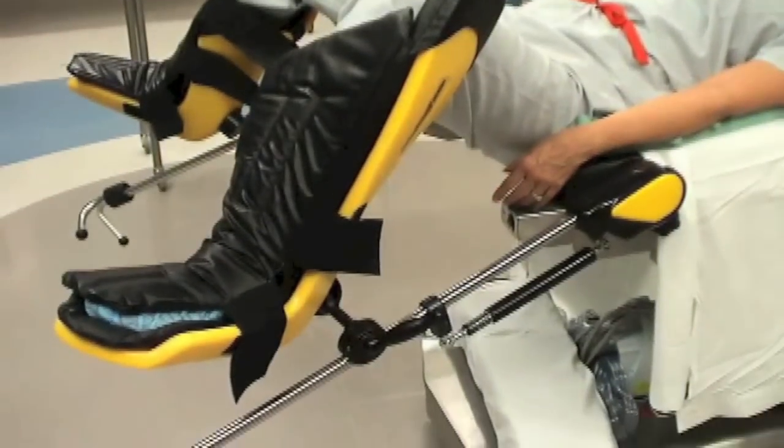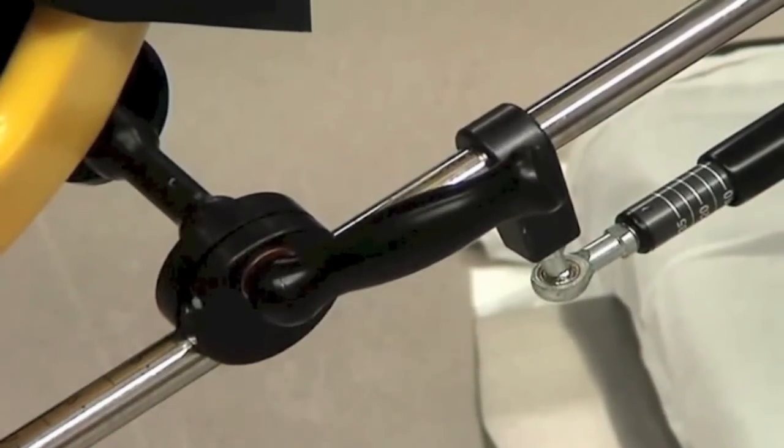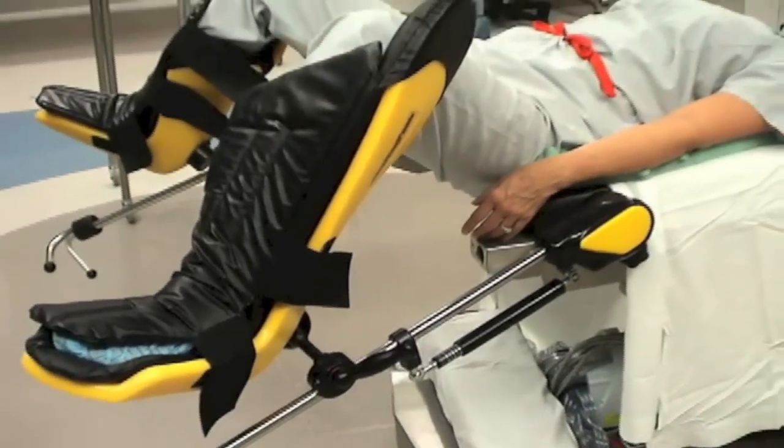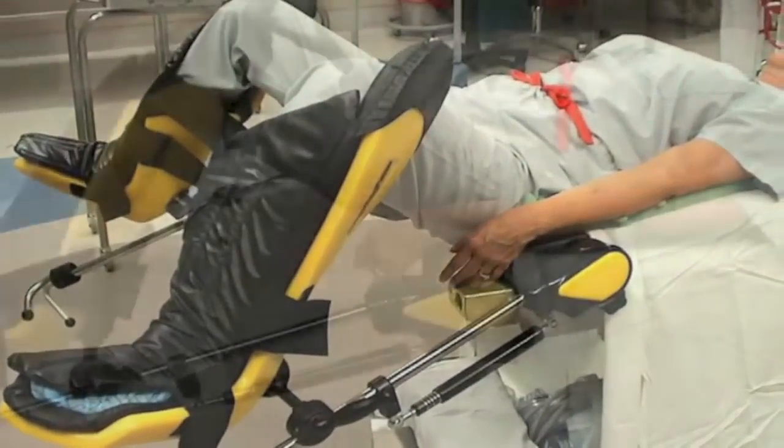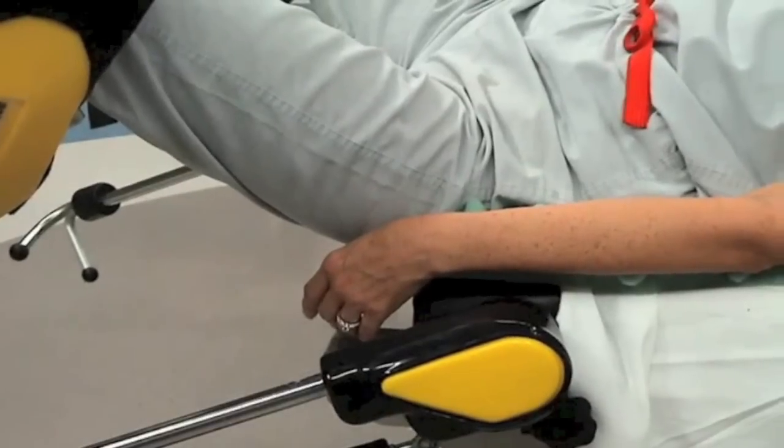Ideal positioning has the boot position and the flexion indicator on the stirrups located symmetrically. With low lithotomy positioning, the hips should be flexed with a trunk to thigh angle at approximately 170 degrees and never more than 180 degrees.